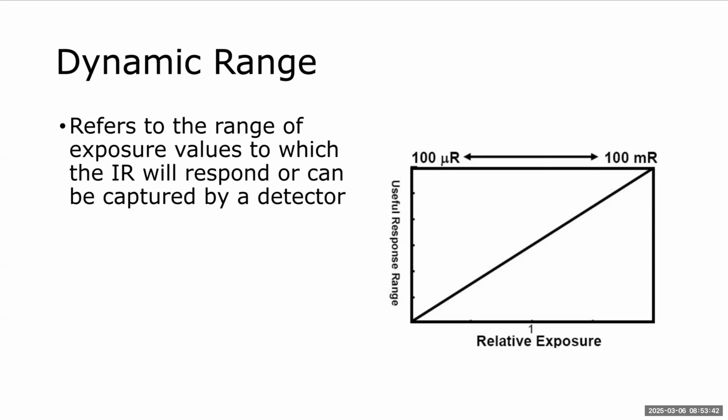And that's one of the reasons that digital imaging, as far as over film screen, was such an improvement, the little amount that it took to get a response.